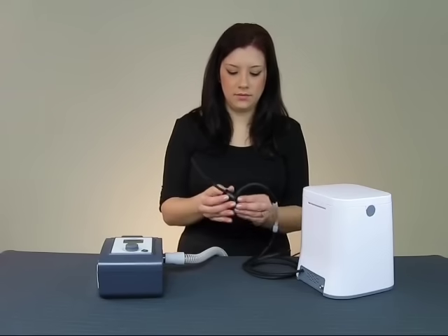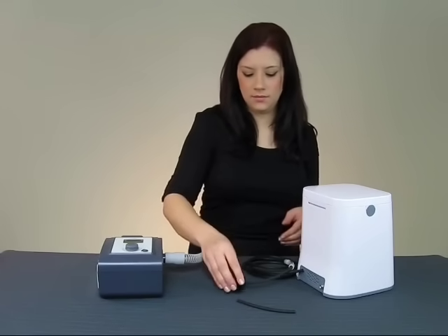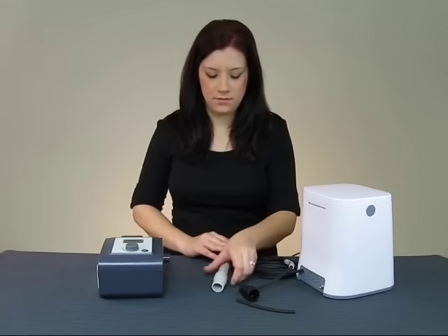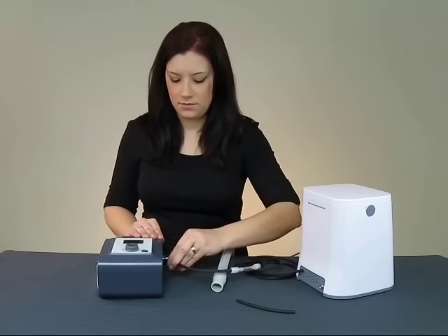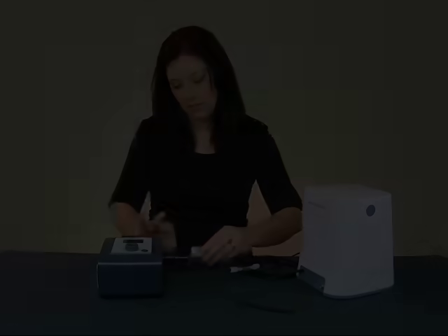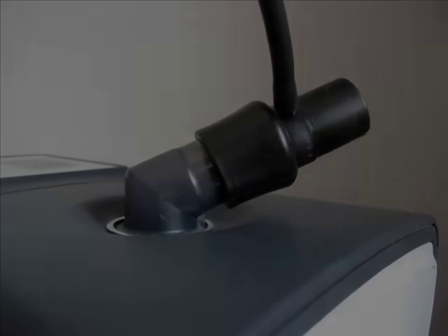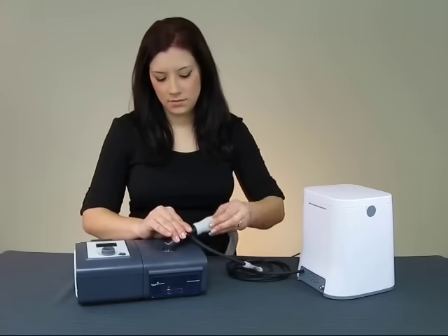If your CPAP unit has no humidifier, remove the short length of black hose from the plastic fitting by pulling it straight out. Then, place the fitting onto your CPAP machine in the spot where your CPAP hose once attached. With your fitting now connected, you can reattach the main CPAP hose to your unit — only now it attaches to the end of the SoClean fitting.